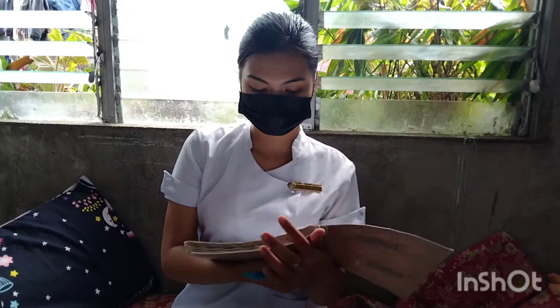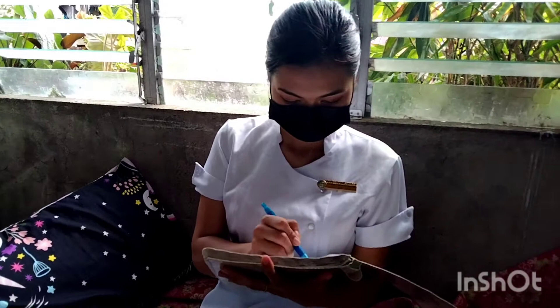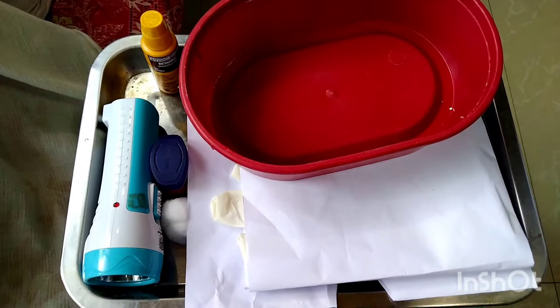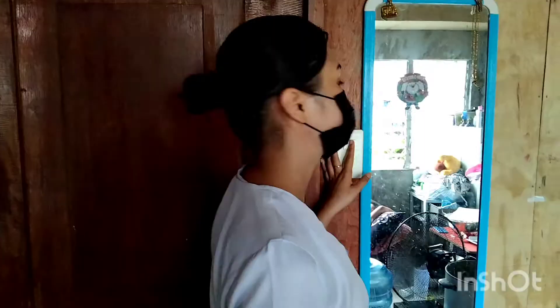Now let us proceed to the procedure. Step number one, in preparation of equipment: obtain treatment card from the nurse and check with doctor's orders. This helps to save time and effort. Step number two, bring equipment to bedside table. After that, check lighting source.